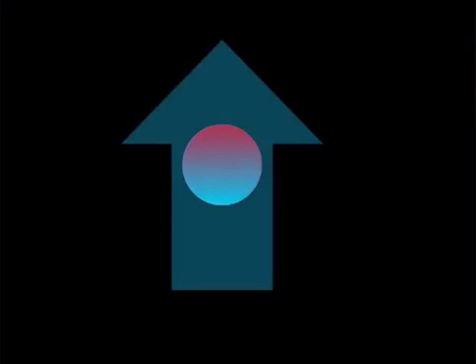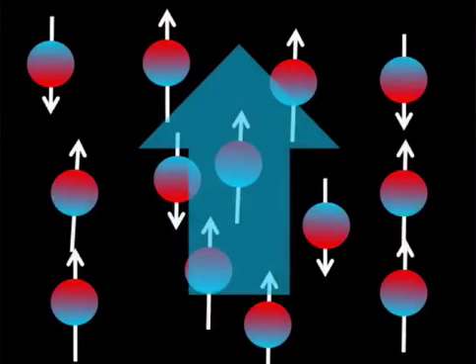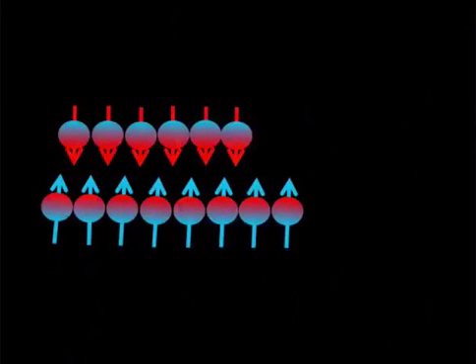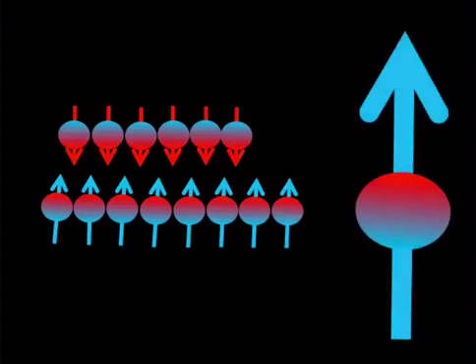So something sort of like this. And then when you apply your magnetic field, it orients in that direction. So, like that. Now notice that some are pointed up and some are pointed down. They're not all pointed up. So there is going to be a majority of them pointing up. And this small excess that line up parallel to the B0 constitute the net magnetization vector, like that. So all these small ones are sort of thought of as one big one with an arrow.